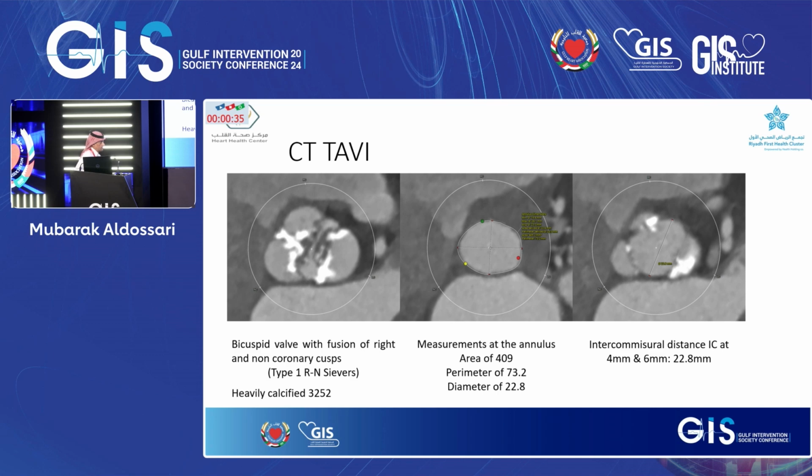In this case, our practice is, our average contrast is about 20 cc's. We use 50-50 contrast, mostly use positioning puffs, don't take injections, and just do echoes. So a case like this, you can easily do with 10-15 cc's of contrast as long as you're using your pigtail markers and your anatomic markers rather than injecting.